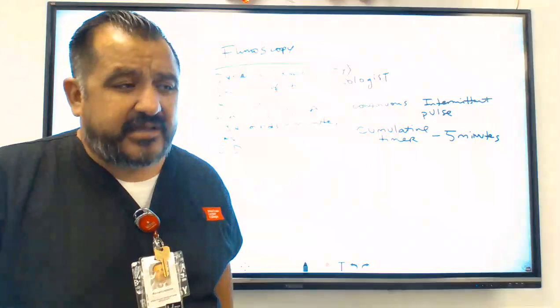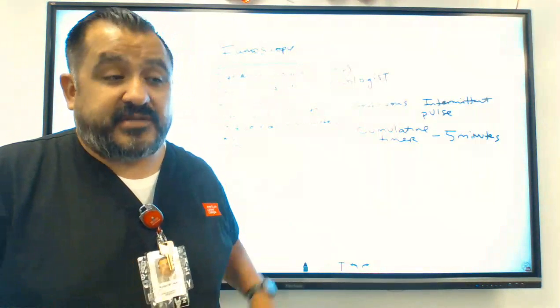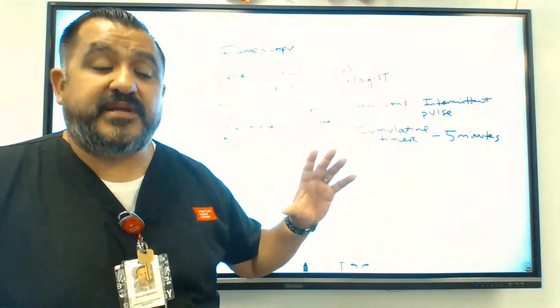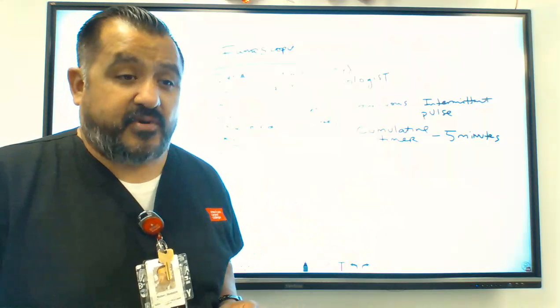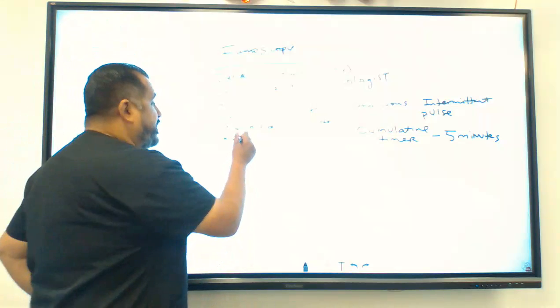If the patient is having some challenges, the timing of the exam could be long, go into the minutes. But there's a cumulative timer that goes off after 5 minutes, and then we can reset it, and it goes back to 0, and then it goes off again. So there's a cumulative timer on that system. It uses kV, which is going to be kilovoltage.